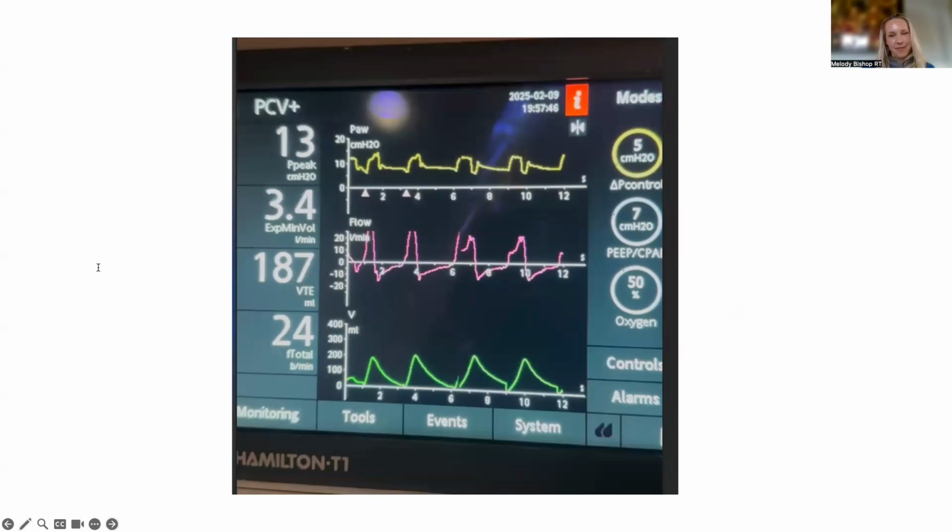So PCV plus, what is that exactly? Presumably it's a pressure mode, obviously, but is that targeting a volume? How does that work exactly? No, this is a full pressure control mode. The Hamilton T1 has added pluses, like CMV plus, to refer to the fact that it's PRVC. I honestly think that in the branding they just didn't want to put pressure control without a plus, and they probably just wanted to look equally cool, so they added a plus. So all of their modes have pluses. It's just normal pressure control. Perfect, all right, pressure control. Got it.